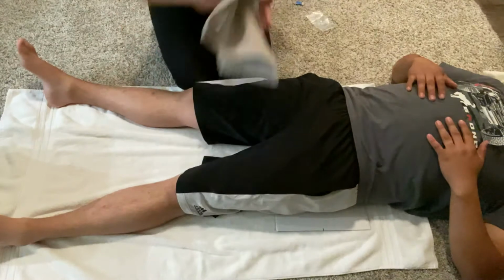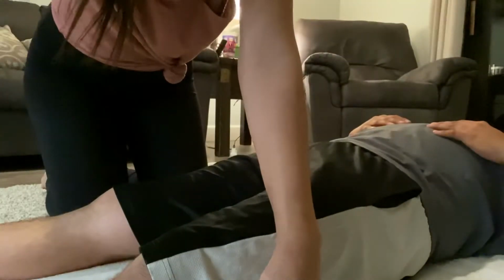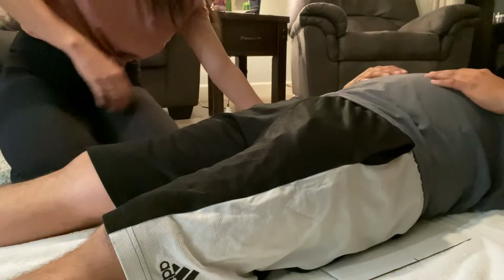Next is our cross table lateral hip. So you can see. Scooch up just a little bit. Okay. Like that way. Just so you can see better. It's really close.